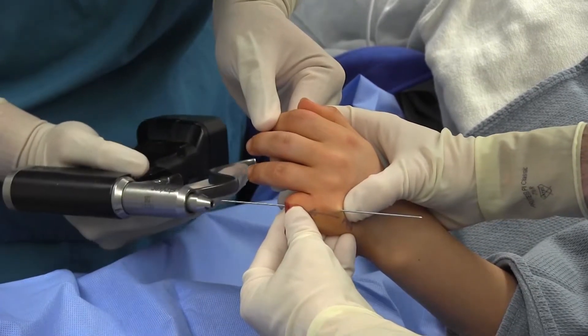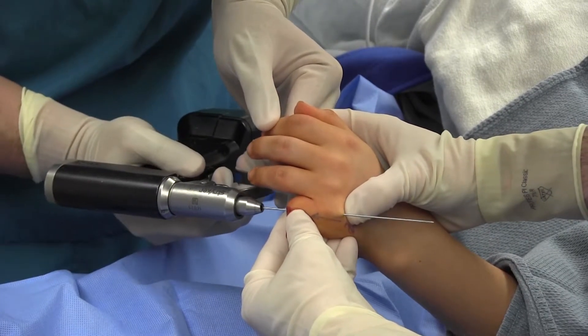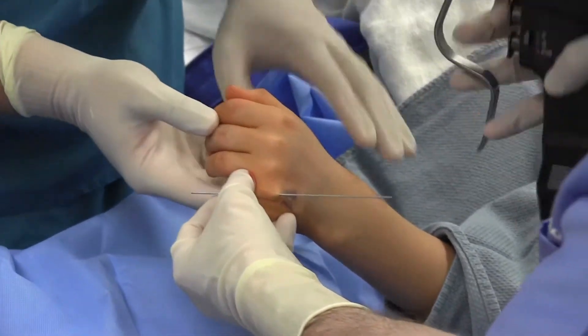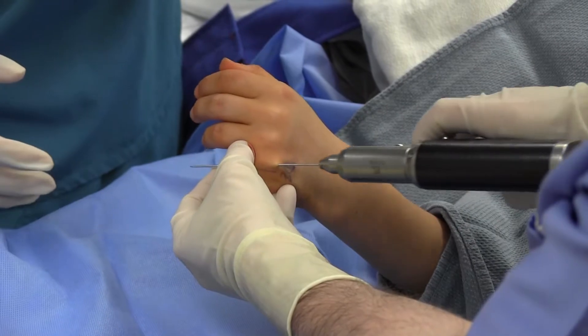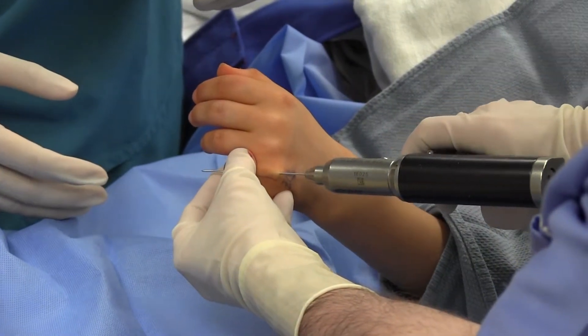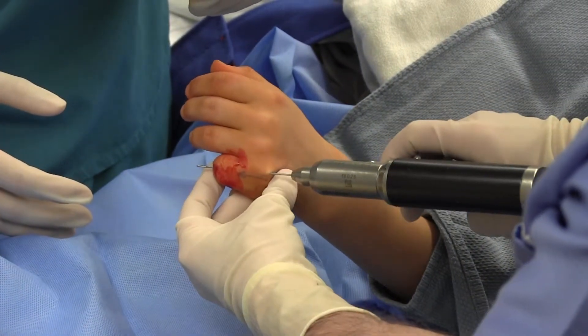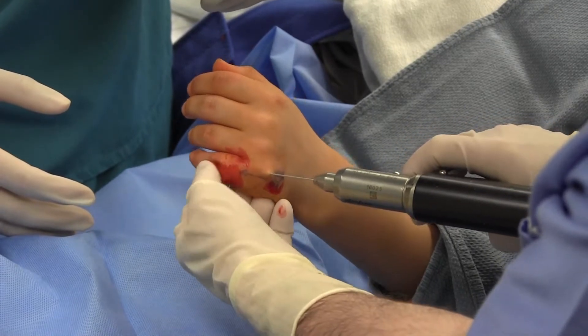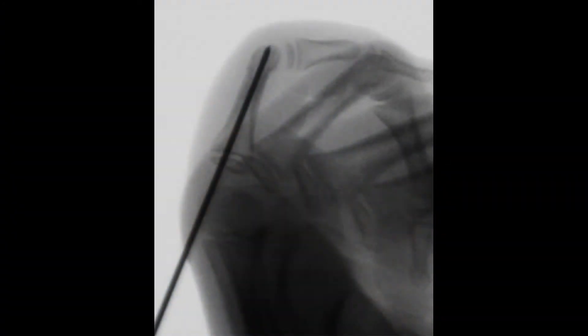The k-wire continues to be withdrawn until it was within the proximal phalanx and the PIP joint. Fluoroscopic guidance is used to assess adequate withdrawal. The PIP joint is now mobile and the k-wire is then drilled antegrade across the middle and distal phalanges.